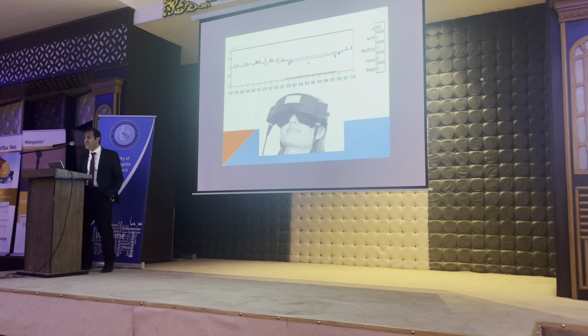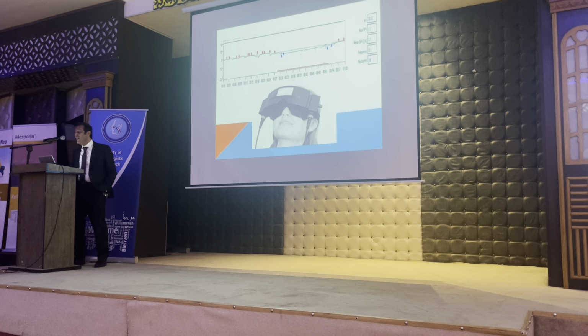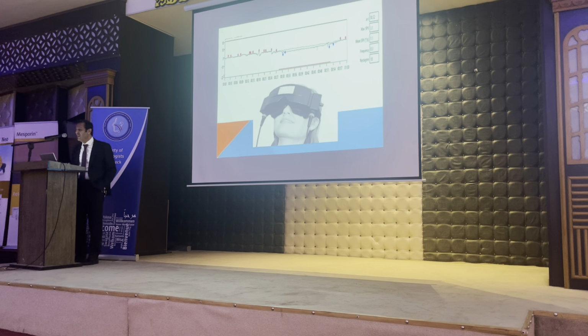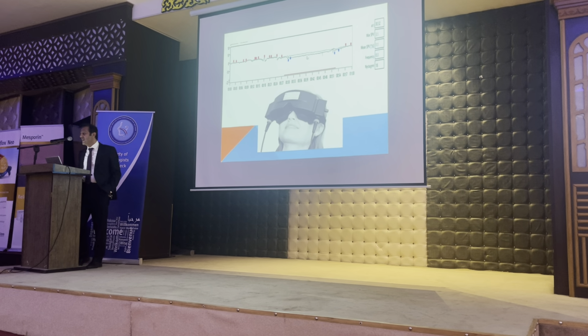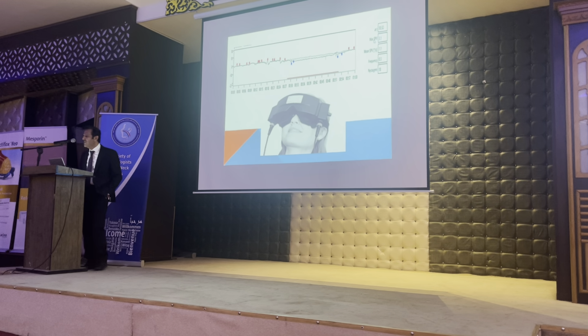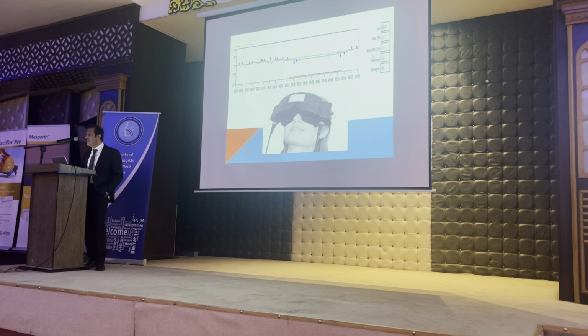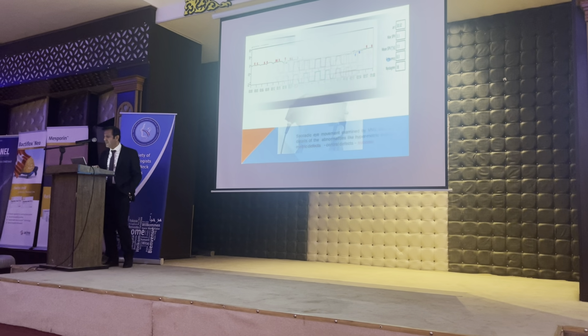So this is a confirmation that this nystagmus is peripheral rather than central, because as you know, if it is gaze-evoked nystagmus, this is central. But now the nystagmus has disappeared because the patient starts looking at the light, so this is peripheral nystagmus. And for the VNG, we can have maximum slow phase velocity, mean slow phase velocity, frequency, number of nystagmus beats in 1 minute, and everything.